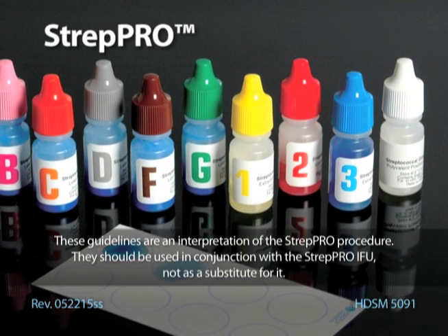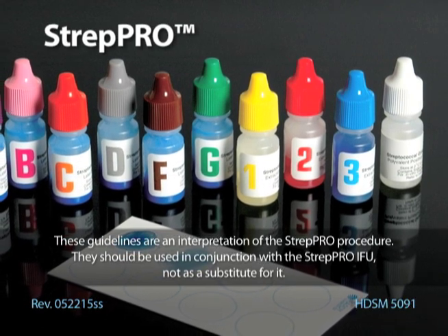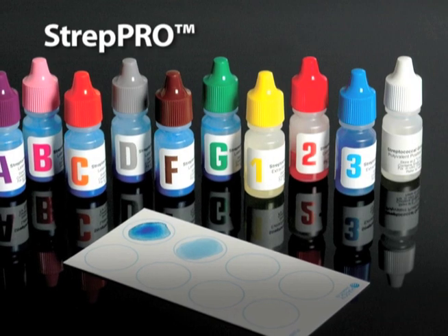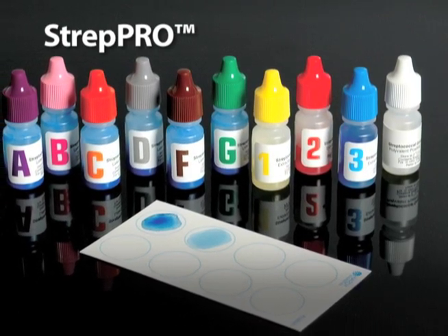Hardee Strep Pro is a rapid latex agglutination kit for the serogrouping of streptococci. It will identify the traditional Lancefield groups of strep into groups A, B, C, D, F, and G.